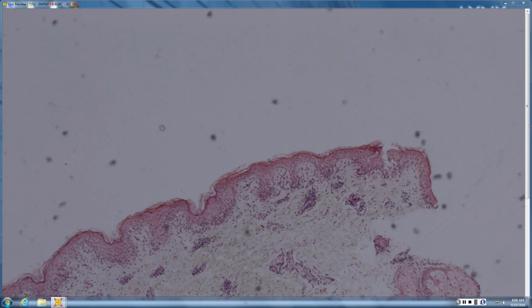So it looks like we have an interface. So you've got an interface dermatitis. Tell me about your corneum. Again, areas are acute and areas subacute. Although I don't see a lot of compact red here, so I'd say pretty acute across. Tell me about where your pigment is. It's down towards the vessels. So pigment deep around the vessels, acute corneum, interface process.